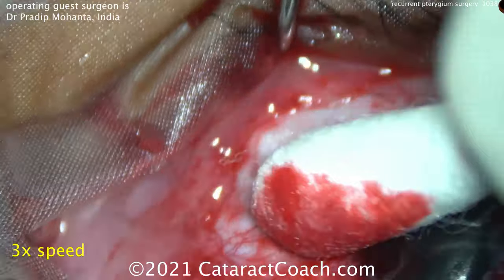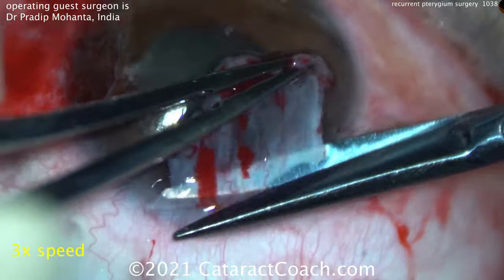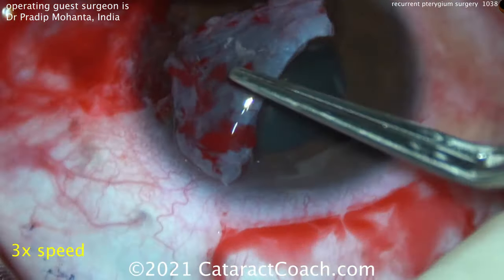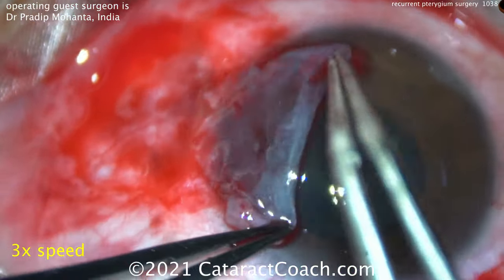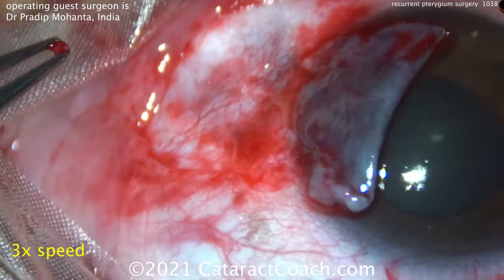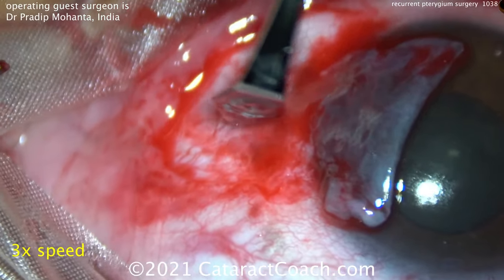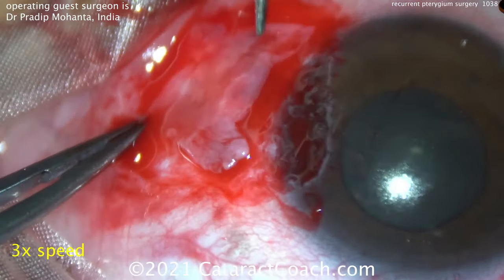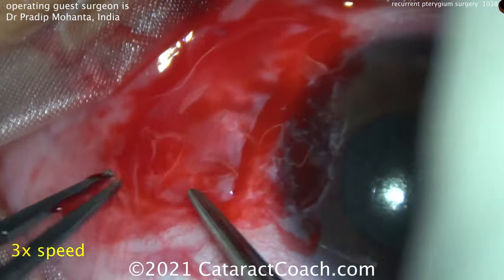Now it's there — cleaning off the bed, drying off any blood. There are only a couple of spots that are oozing. Cutting the graft off, you have to flip it back over — you want the epithelial side up, of course. Now he's placing it over the cornea, drying off the bed. To make sure he has some fresh blood, he's going to use a blade and do a few nicks of those capillaries just to get some fresh blood oozing.